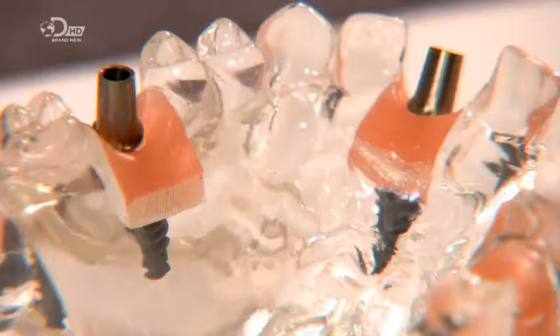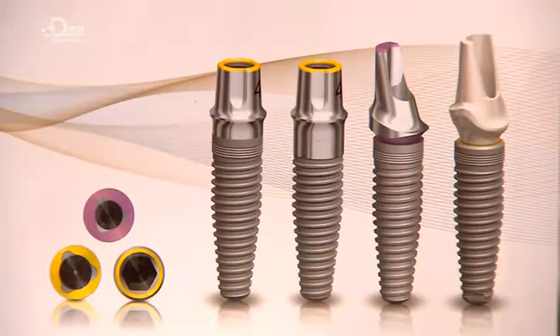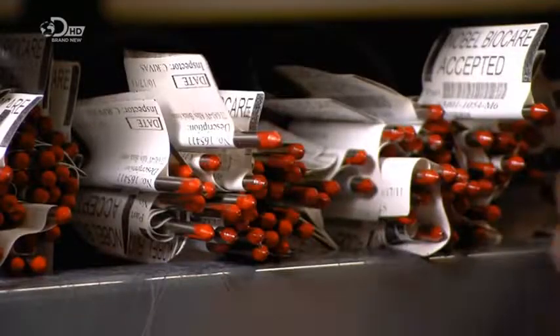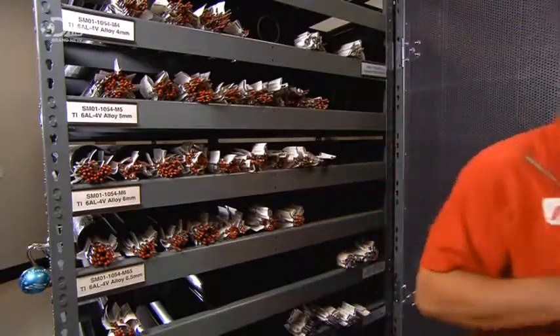In the middle of the 20th century, it was discovered that titanium is a metal that bonds with bone. It revolutionized restorative dentistry, making enduring tooth implants possible. To make these implants, they start with a solid titanium rod. This 4-meter rod will be used to make more than 200 implants.